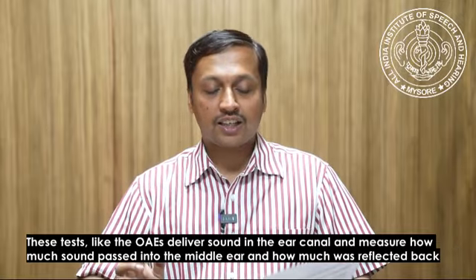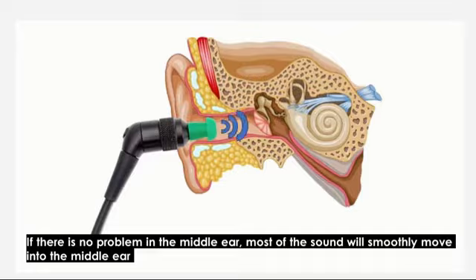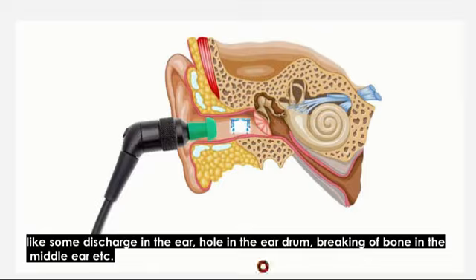These tests, like the otoacoustic emissions, deliver sound in the ear canal and measure how much of the sound passes into the middle ear and how much was reflected back. If there is no problem in the middle ear, most of the sound will smoothly move into the middle ear, and if there is a middle ear pathology, sound will be obstructed and most of that sound will just be reflected back. From this, we come to know if there is a middle ear issue or not, like some discharge in the ear, hole in the eardrum, breaking of the bone in the middle ear, etc.